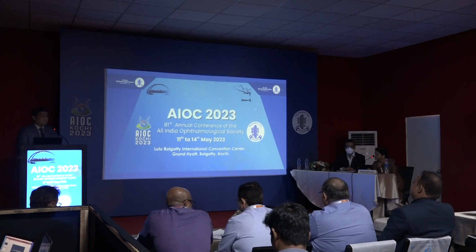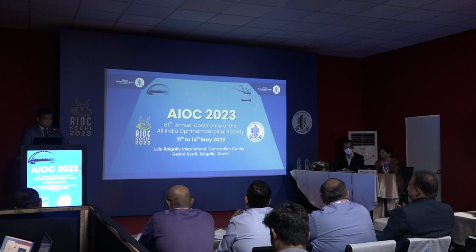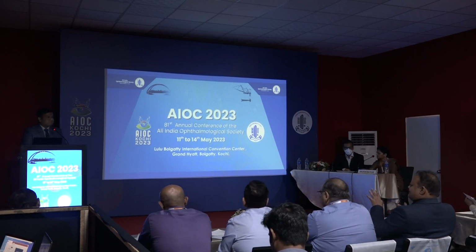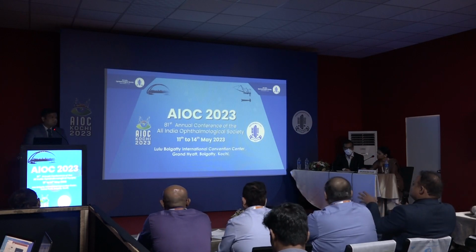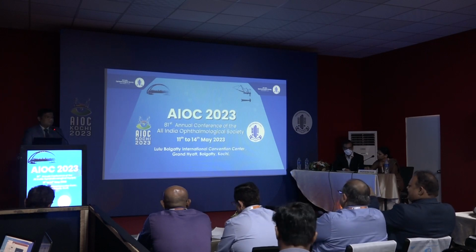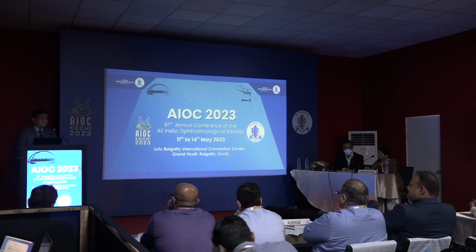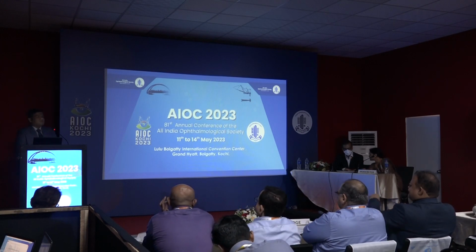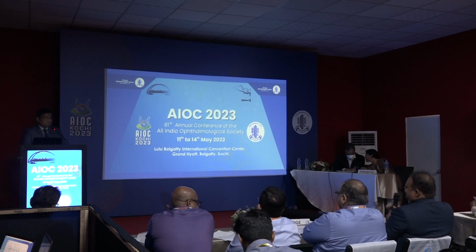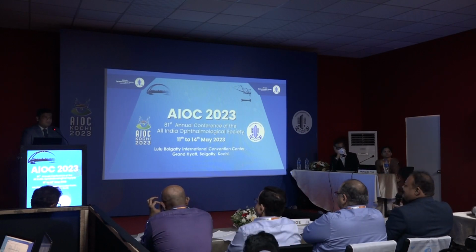Dr. Ankit, it's a nice, innovative way of doing things. But what is the clinical implication? Because most of the things we want to see in an OCT is the central macula. So what extra information do you get by having this wide field OCT? Like in a DME, as you mentioned, it's the hard exudate near the arcade. But how does it help in my treatment?